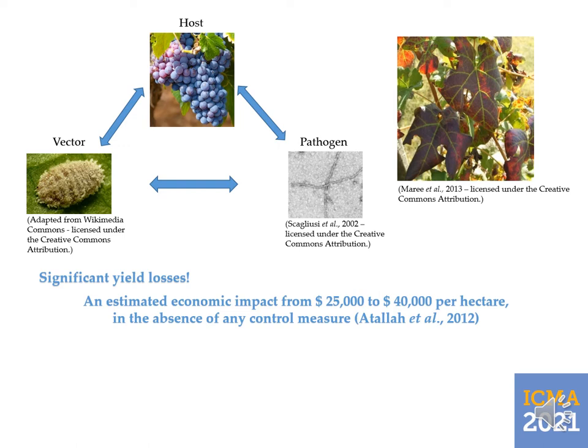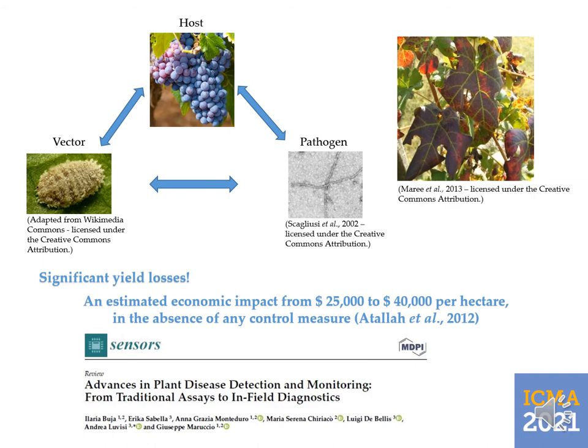Unfortunately, there aren't any cures for this pathogen, but only preventive actions such as the use of clean stock and certification programs, as well as the use of certified material derived from virus-tested stocks for new vineyards. As reported in my recent publication, innovative tools are suitable for field use, and portable systems such as the lab-on-chip can make the difference in preventive action.